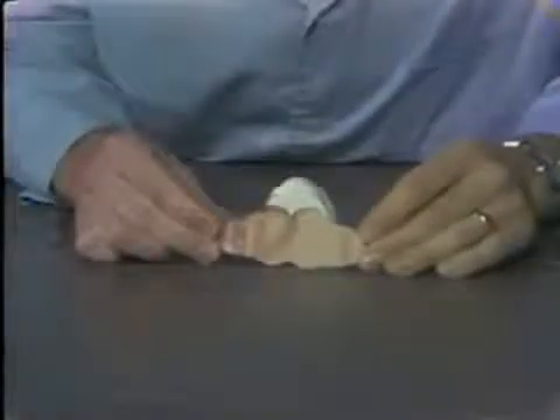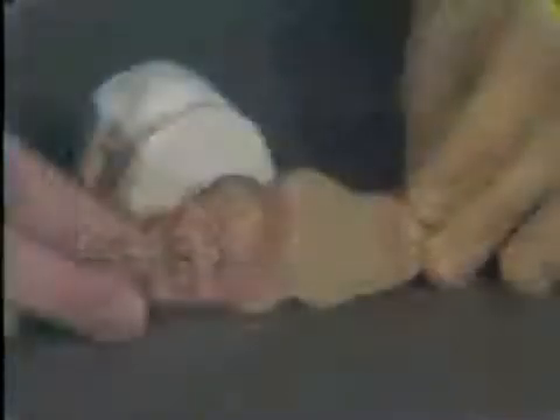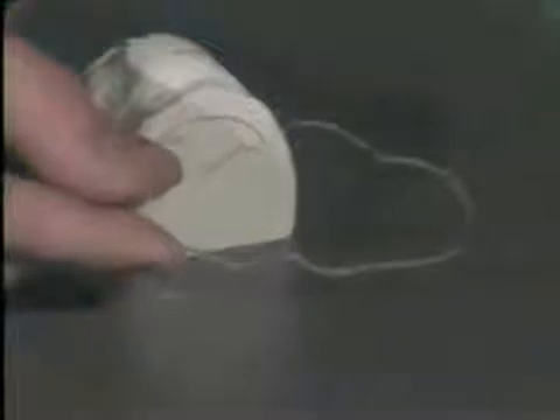Here the plexiglass has been trimmed to the pencil line. The paper covering on the plexiglass is removed, and it is now ready to be adapted onto the work model.